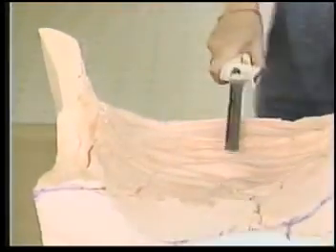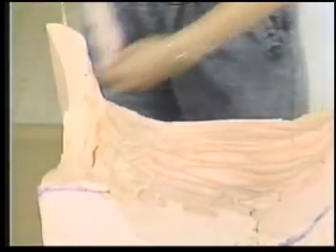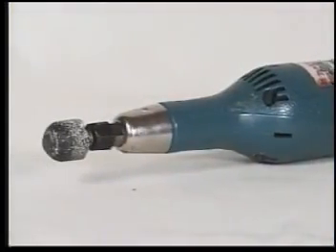The final trimming process involves smoothing procedures. Areas caused by bag wrinkles can be glued back together. Ridges from clothing folds can be cut away. Additional clearance around the hip area can also be provided by trimming where desired with the electric knife or a high-speed Dremel, which is a hand die grinder. Once the trim is finished, the bottom and back inserts can be glued together to form a molded insert.